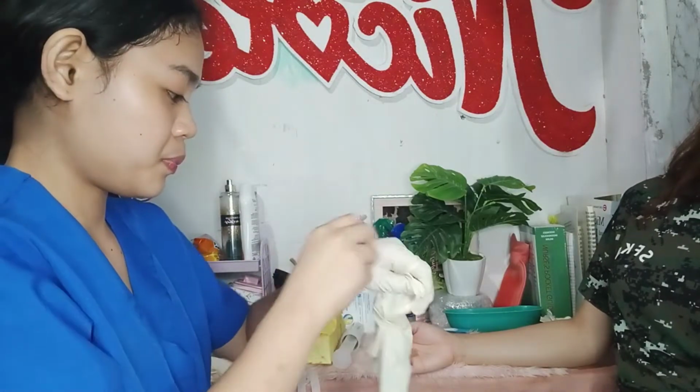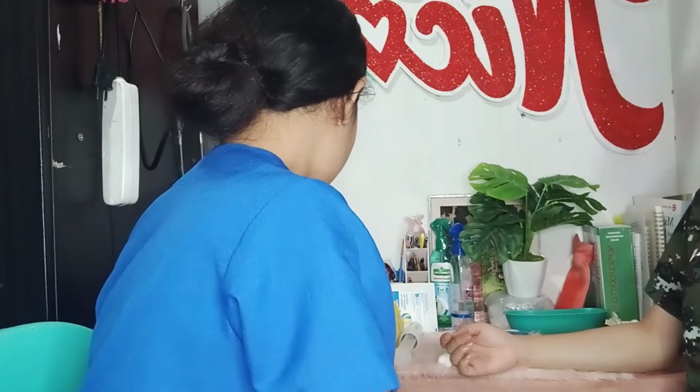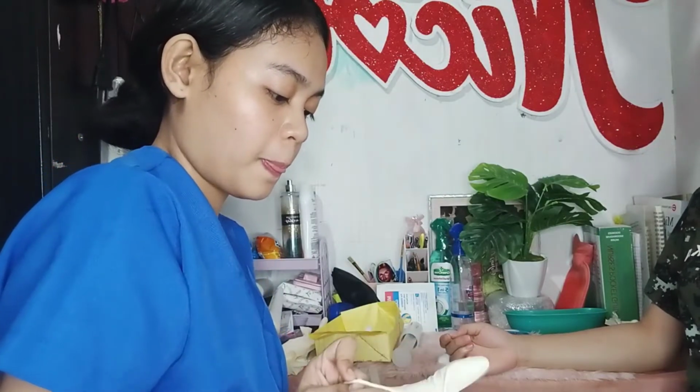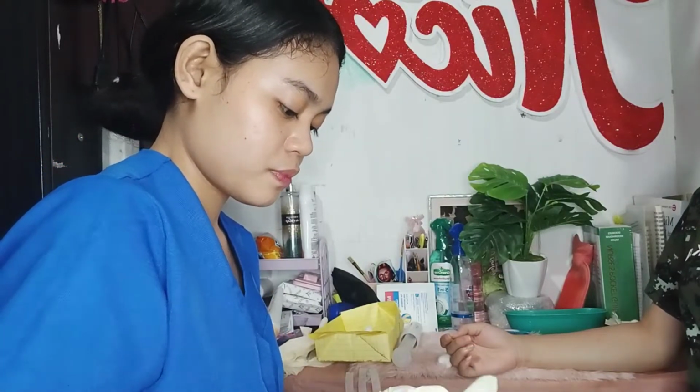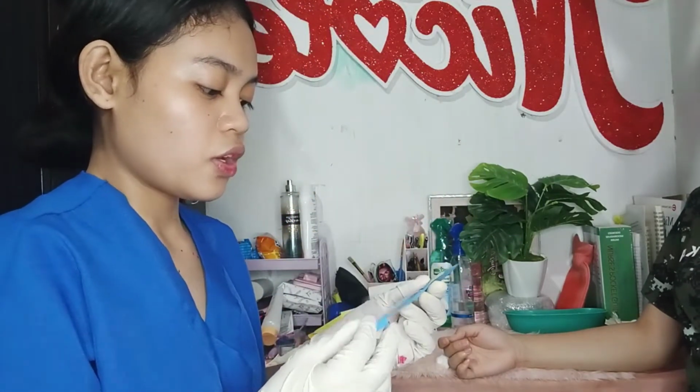So but first, we are now going to use another pair of gloves to obtain the specimen. So I am going to use another pair of gloves to obtain the specimen. So now I am going to obtain the specimen. So I am going to use this swab. So this is just an improvised specimen tube.